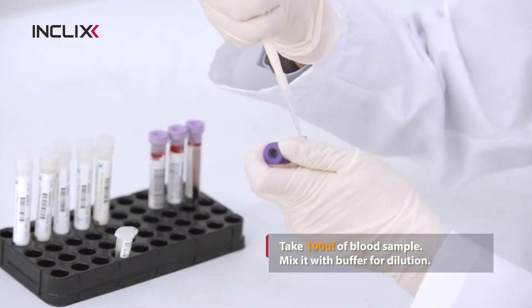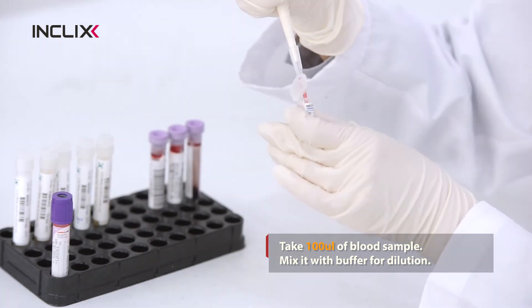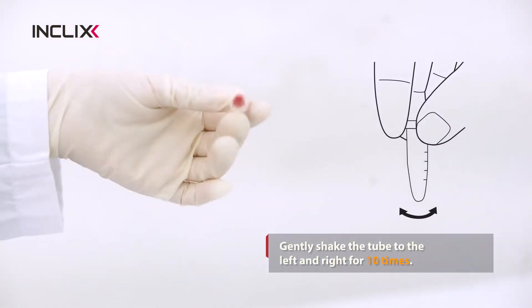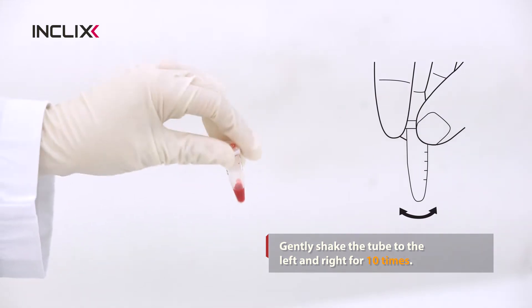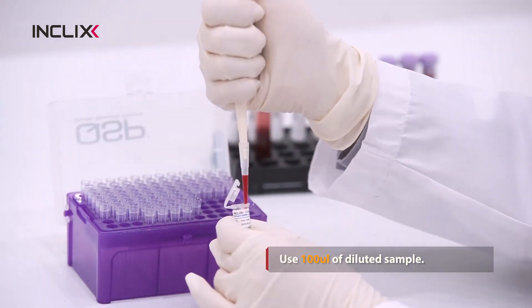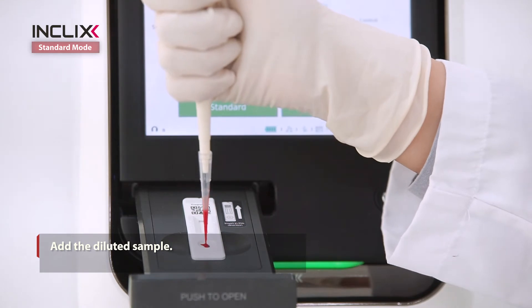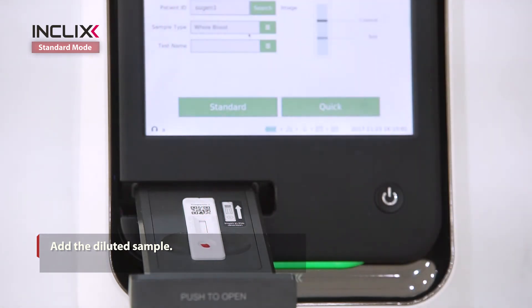Take 100 microliters of blood sample and mix it with buffer for dilution. Gently shake the buffer tube to the left and right 10 times. Use 100 microliters of diluted sample. Add the diluted sample into the sample well of the test cassette and close it immediately.